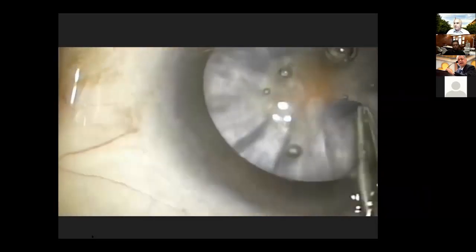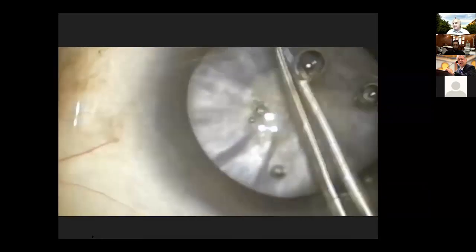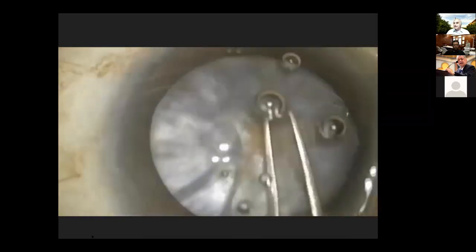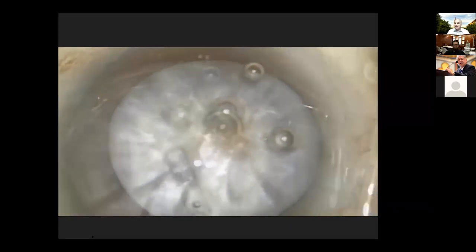You see, now everything is in control. I can make it this size, I can make it a larger size. There is nothing out of control. So the whole message I want to give here is how to convert a difficult case, where you are afraid something sudden will happen that will disturb all your plan for the surgery, in a very reproducible manner.